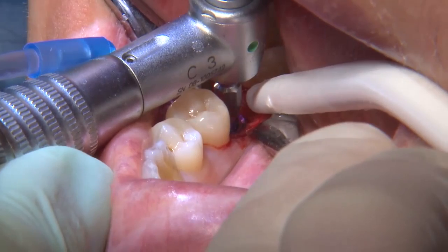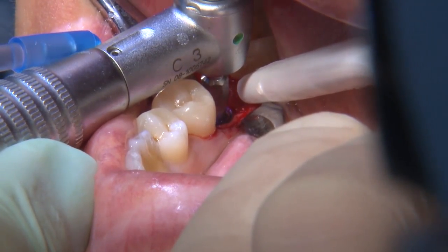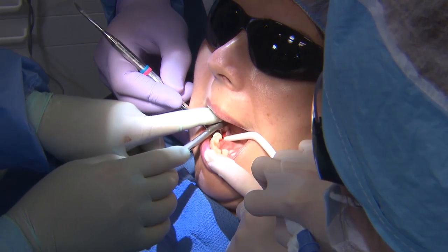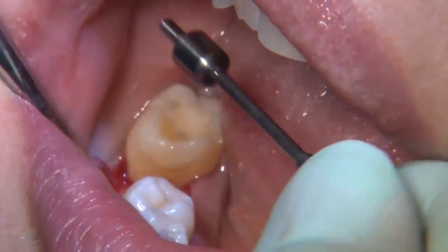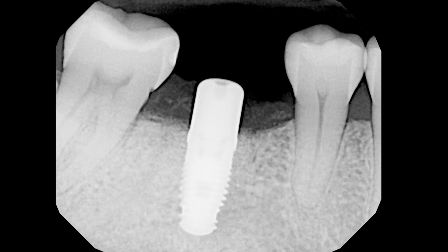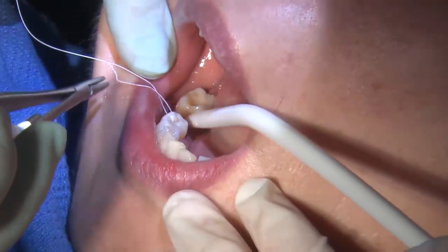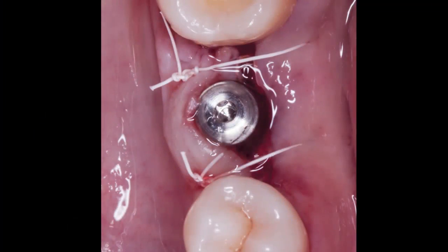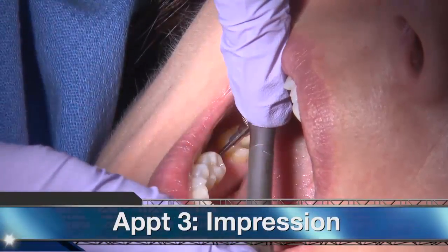This implant had an internal hex connection with a 3.5mm platform, and the recommended placement is at the bone level. To verify primary stability of the implant, I used a hand torque wrench, and you can see here it is indicating about 35 Ncm. To prepare the implant site for healing, I selected a 4.7 x 5mm healing abutment. The final radiograph confirmed proper seating of the healing abutment, as well as the positioning of the implant in the alveolar bone. Once the healing abutment was placed, I used simple interrupted Gore-Tex sutures, with plans to remove the sutures after 14 days, and allowed 12 to 16 weeks for osseointegration. During the healing phase, the patient continued to use her previously made Astron bite splint.